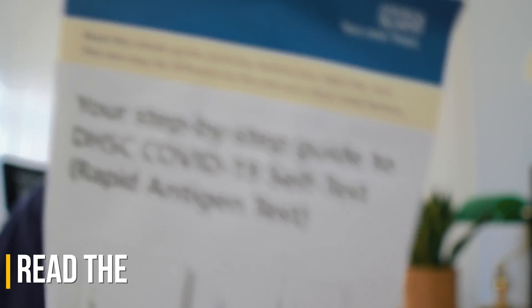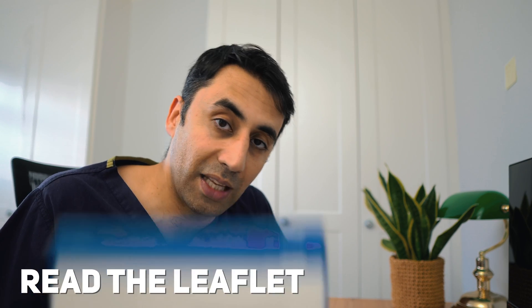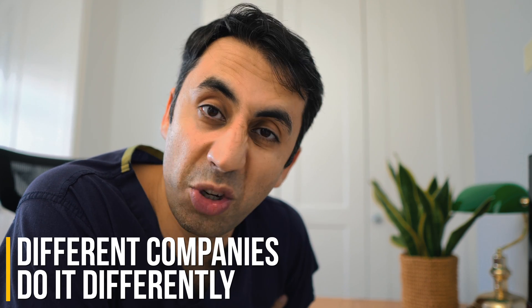Firstly, have a quick read of the leaflet that comes with the lateral flow so that you know all of the steps. No, but seriously, go read the leaflet. This video is for the NHS one, but we recently went abroad and the company that we had the lateral flow from just had totally different instructions, so you don't want to do it wrong.